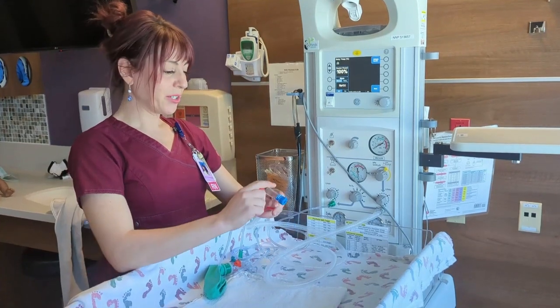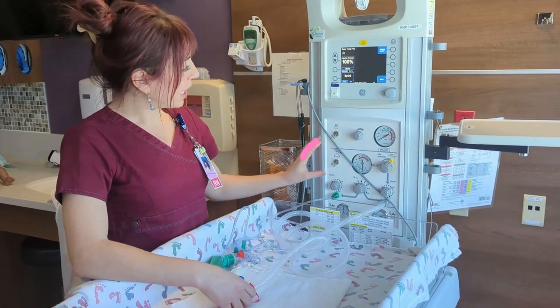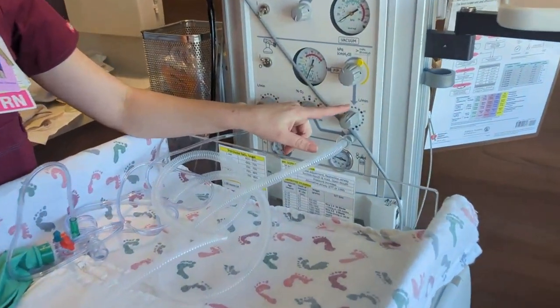To test this out, we're going to occlude the cap — you can do this with the lid that comes with it or just using your hand — and we're going to turn on our airflow. We want our flow always to be at 10 liters per minute.